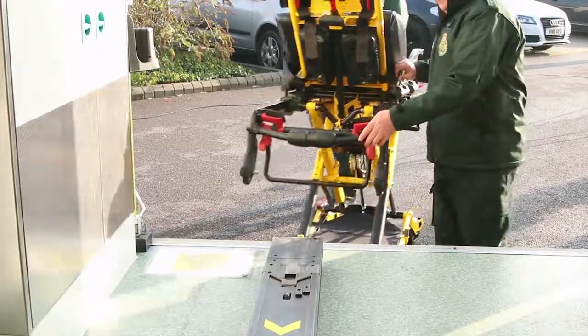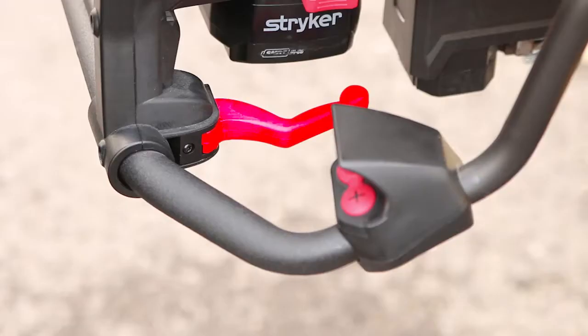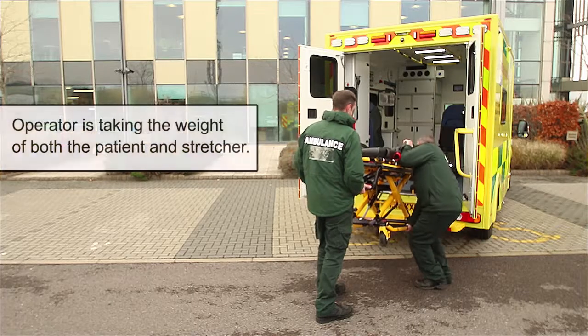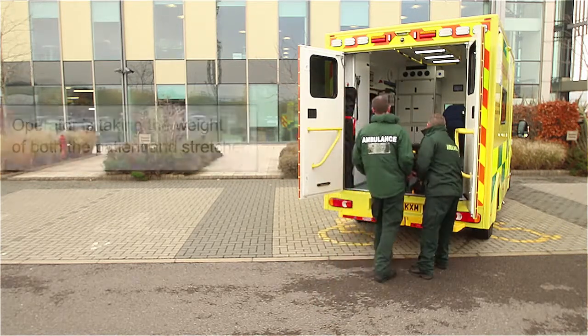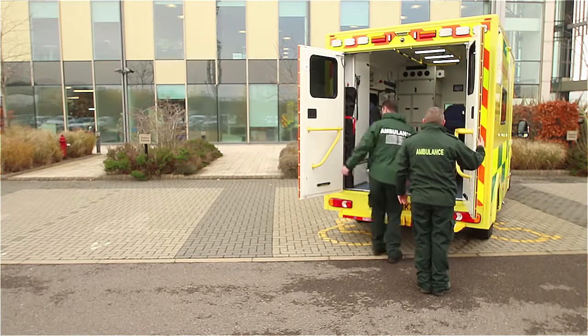Loading the stretcher: guide the stretcher towards the safety hook in the vehicle and hook it onto the safety hook. Locate the manual backup release lever on the stretcher; one operator pulls the manual backup release lever while the other manually retracts the stretcher legs fully. Guide the stretcher into the vehicle until it comes to a complete stop.